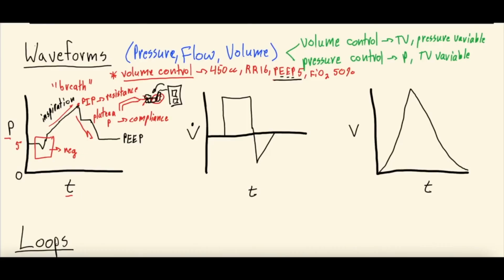If it is under pressure control, so we said this is in volume control, we're just going to draw right here quick. If it were pressure control, the shape of the curve looks a little different, because you're setting the pressure, so it'll look more boxy, right? So it'll look like that, although I apparently am a little slanted. That was unintentional. But it'll just go straight up like this and come down. And this would be under pressure control settings. So again, you still have your PEEP here.